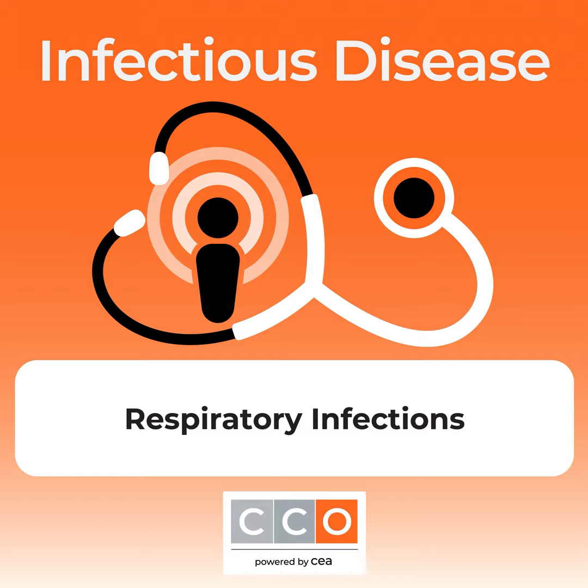Just starting off with the basics, what is a syndromic panel? Usually it's a molecular assay, often multiplex PCR based, but sometimes other methods. But the point is that they can simultaneously detect and identify multiple pathogens that are associated with a given clinical syndrome. So for example, there are syndromic panels for bloodstream infections. We're going to talk today about the ones for respiratory tract infections, but they have panels for gastrointestinal infections, joint infections, CNS infections. And some of these panels can also detect antimicrobial resistance genes that are carried by common bacterial pathogens. So sometimes they can tell you not only what's there, but also give you some information about antimicrobial resistance of whatever pathogen might be there.